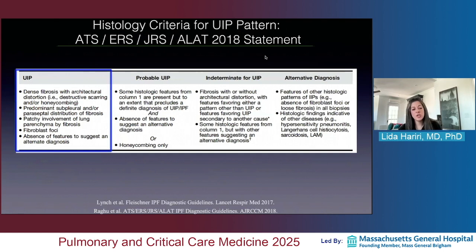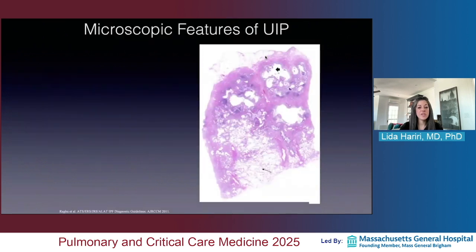Okay, so now let's talk about what the pathologic criteria of UIP and the things that are in the differential of UIP are. Here is an example of a classical UIP, which I'll be honest with you, would never get biopsied anymore, because I can tell you right now, these honeycomb cysts are well over 2 millimeters in diameter and would clearly be visible on CT. But it's a nice case to be able to illustrate really clearly what the pathologic features look like.